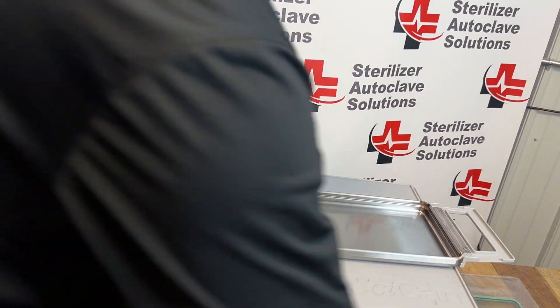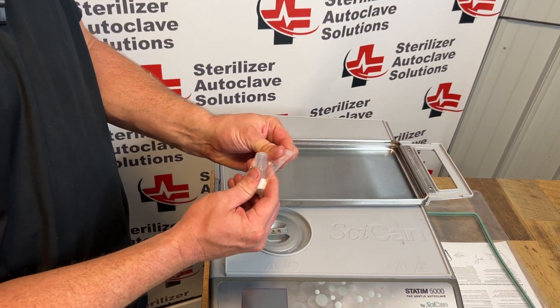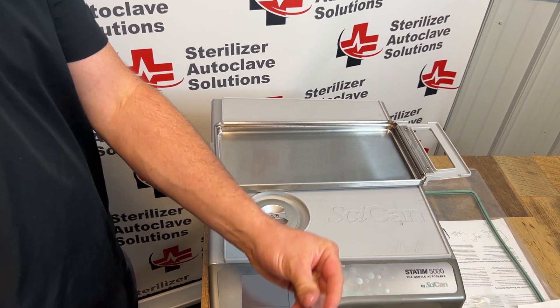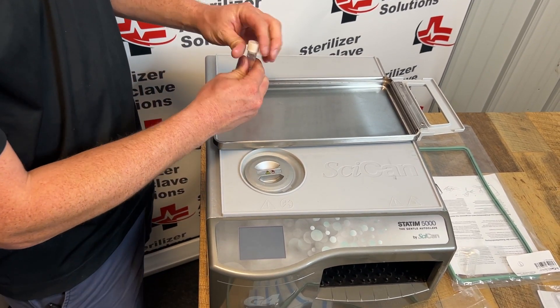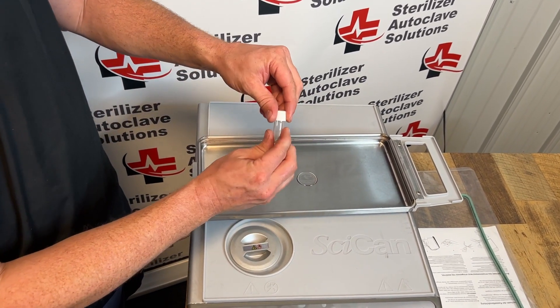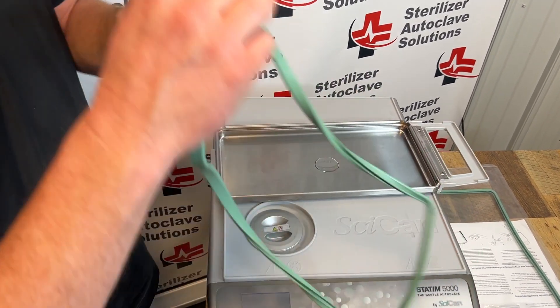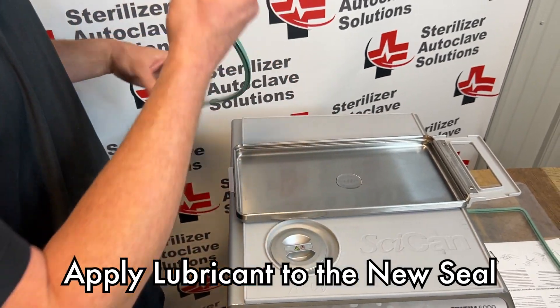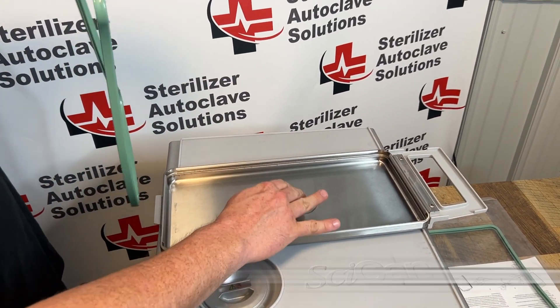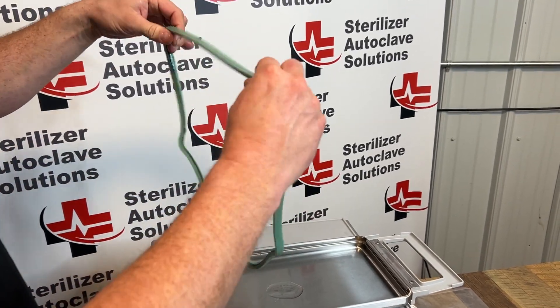Once we know that's good, I'm going to take some of the provided lubricant that comes with the new seal and pour about half this vial into the middle of this cassette. Next I'm going to take the cassette seal, put a couple fingers in the lubricant, and lubricate this seal all the way around.